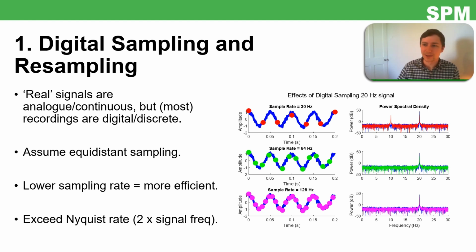or they will start at the original sampling rate, 1000, and then plot the PSD, then downsample to 200, plot the PSD again, and see if any aliasing has occurred. But to be honest, people talk about the Nyquist rate and then it seems to never be used. So, with a pinch of salt, I guess.